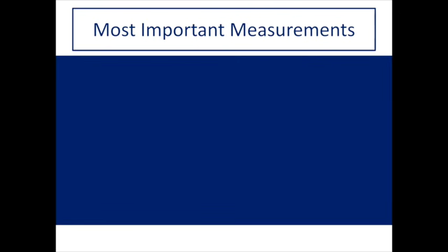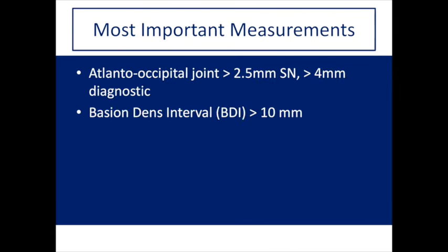So these were mentioned in the anatomy and pearl sections, but I've put them here for reference. You don't necessarily need to memorize them, but know where to look and get used to what looks normal. You can always keep these numbers accessible to you on call so that they can easily be accessed.